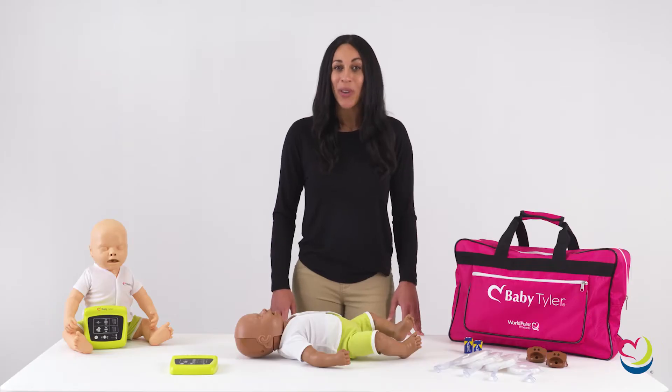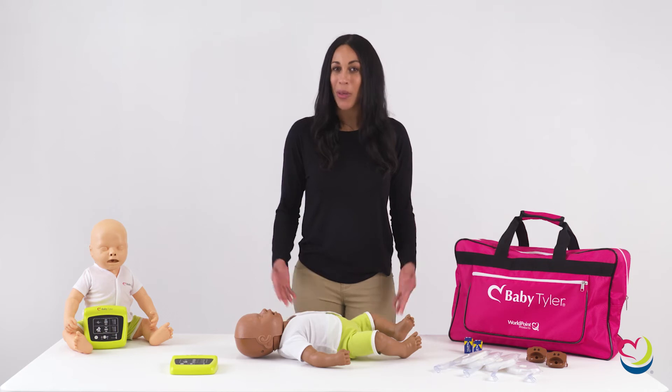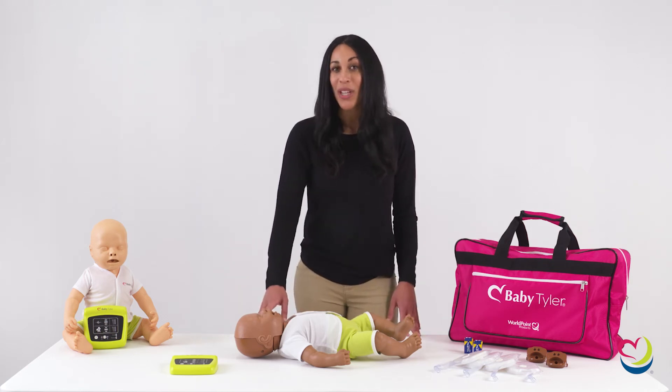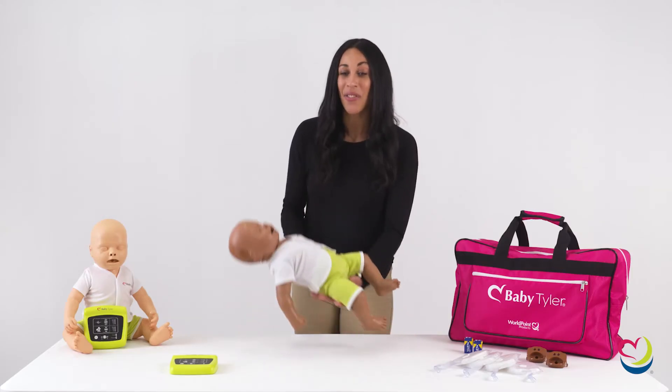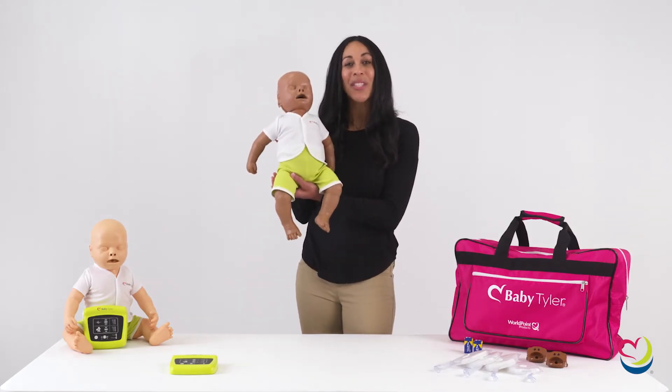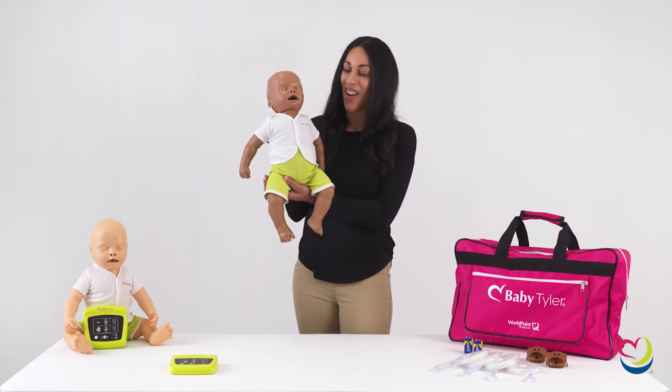To practice with an oral pharyngeal airway, remove the mouthpiece and replace the skin before measuring and inserting the airway. In addition, Baby Tyler may be used to practice back blows and chest compressions for infant choking relief. Weighing less than 5 pounds, Baby Tyler is ideal for portable and on-the-go training.